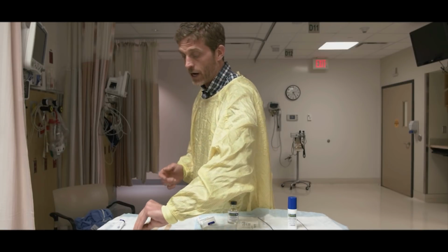Checklist. Just like we have a checklist here in Calgary, our airway management pause, it's referred to, but it's a formal checklist that we go through prior to every intubation that isn't a crash intubation. And I think it's very important to go through a checklist for this procedure. I don't expect you to remember. I'm not going to remember how much lidocaine that is, but it's on my checklist, and when I'm going to do this procedure, that's coming up on my device.